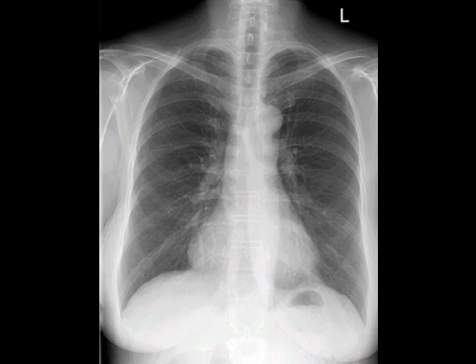The properly exposed x-ray is one in which the tiny spinous processes — those little points on the spine — are visible even through the middle of the mediastinum toward the diaphragm. That's it! I think you've got it. Next time we'll take a look at pathology in part two.